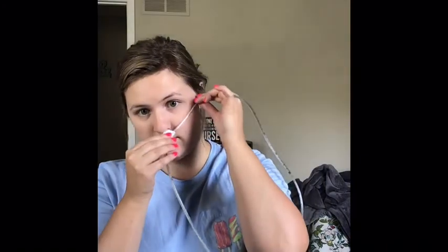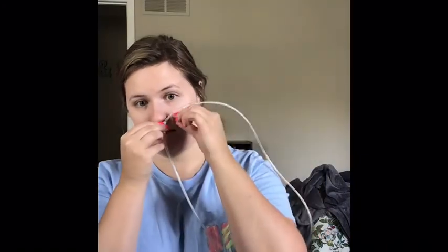Because it's really uncomfortable. So when you tell them to swallow and they keep swallowing, just keep pushing it through. So you're swallowing, you're going to have them tuck their chin, and you're going to keep going, keep going, keep going, keep going, keep going. Okay, so now I'm at my mark right here.